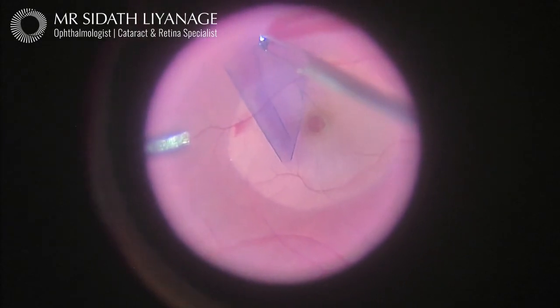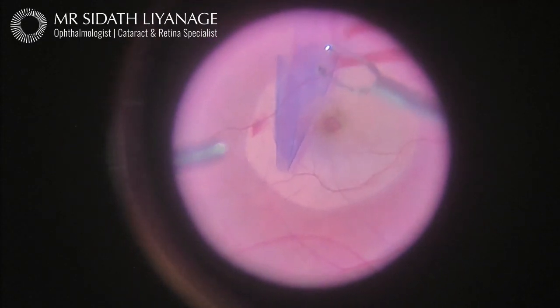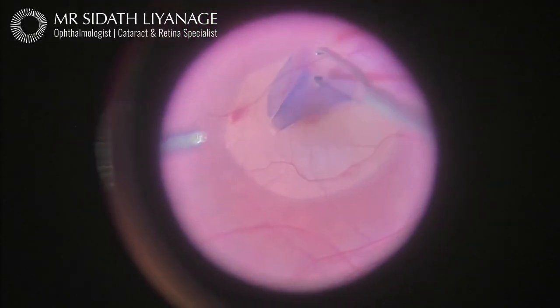Before performing this step, I remove the vitreous gel by vitrectomy, and after the peel, I will fill the eye with gas to help support the macular hole as it closes. This entire operation usually lasts less than 45 minutes.